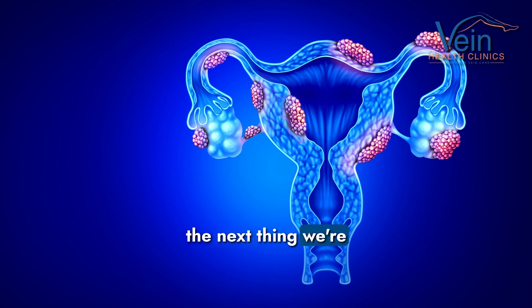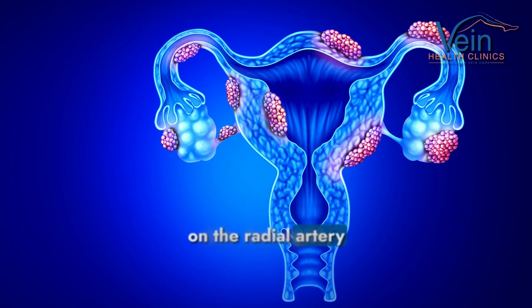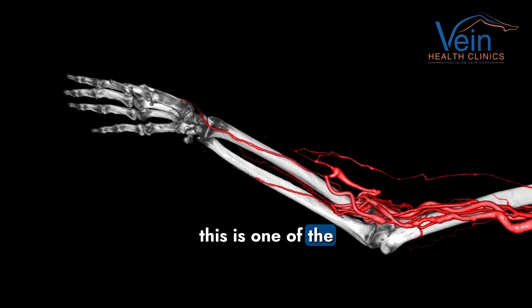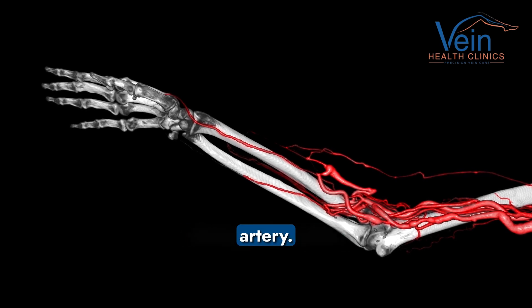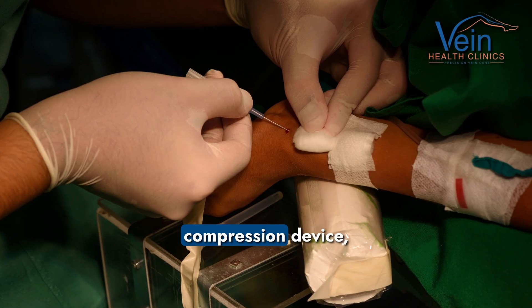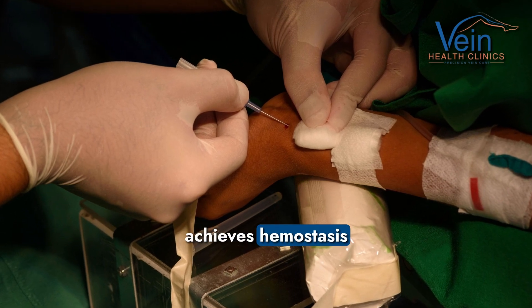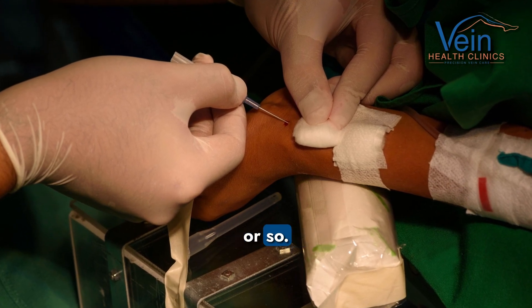Once we're done with the procedure, the next thing we're going to do is basically try to achieve hemostasis on the radial artery side. And again, this is one of the advantages of going through the radial artery. We're just going to put in this device called the radial compression device, and that essentially achieves hemostasis on the artery in about 30 minutes or so.